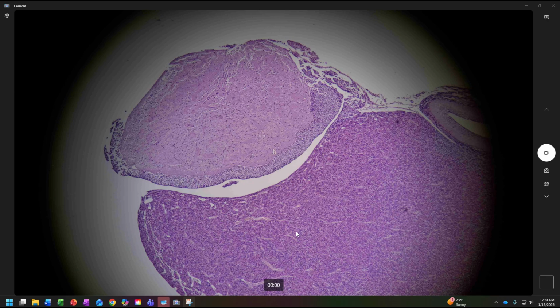One of the things I always talk about when you're studying these is to look at the things that are visually distinct from each other. So what are the things you can look at here and say, okay, this just looks different from another part? We can see very quickly that we have this area over here, a little lighter in this purple color, and then we have this darker area right here.